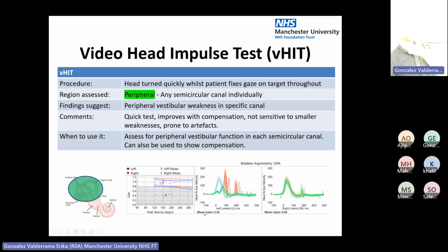You might see this if you see the patient within the first week of their vestibular neuritis, but by month 4, it might look more like this, with a scattering of saccades on it. That's another reason to diagnose these people early on, because then you have much more concrete proof of what happened, and we can very confidently send them into vestibular rehab, or not, or send them somewhere else. But it's important to get them early, basically.